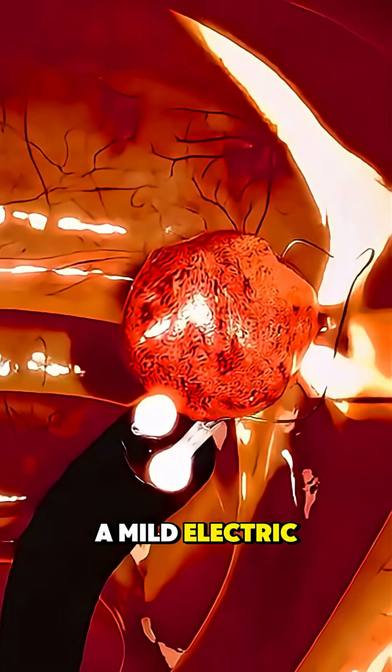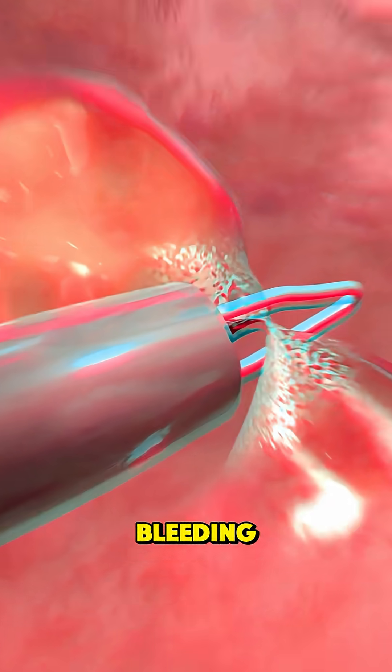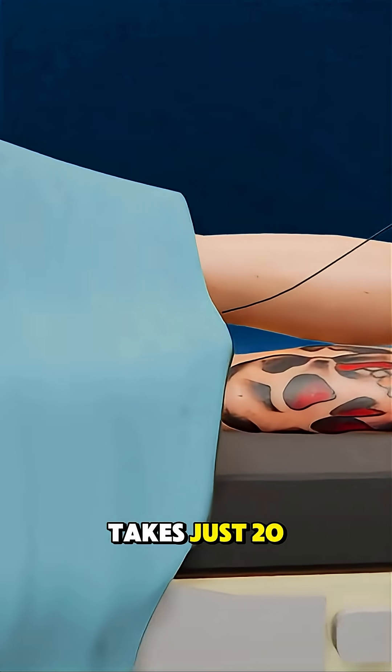The snare is used to grasp the polyp. A mild electric current is then used to cut the polyp away and seal the area to prevent bleeding. The entire process is safe, effective, and usually takes just 20–30 minutes.